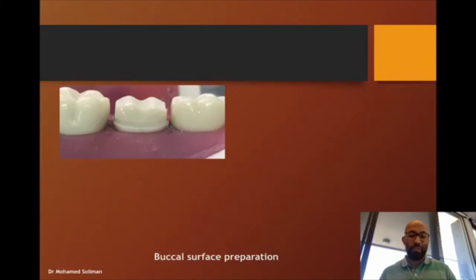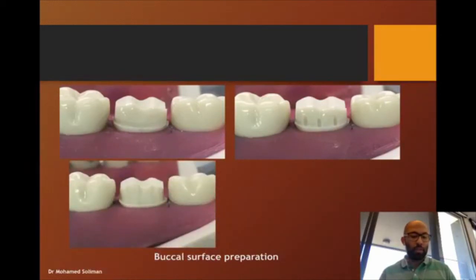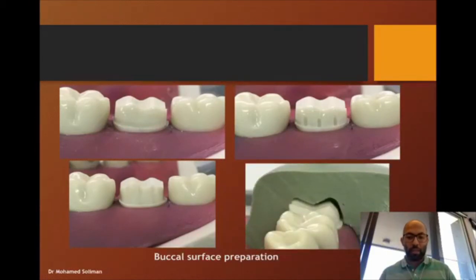You can do it with a pencil if it's allowed, or you can use a burr. I actually mark the tooth with the burr first, and then I put my depth grooves, usually on the buccal surface. Don't forget to do it on two planes. You can do the gingival, the cervical third, and then the other plane should include the middle and the occlusal thirds. So I do two planes of depth grooves, two reduction planes, and the last picture shows the result after I do the buccal reduction.